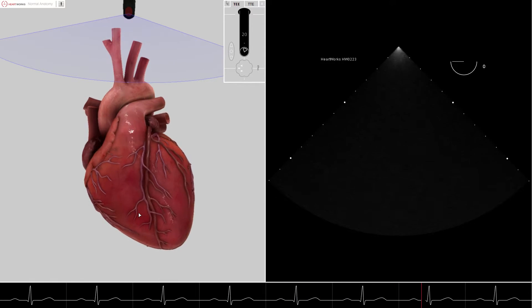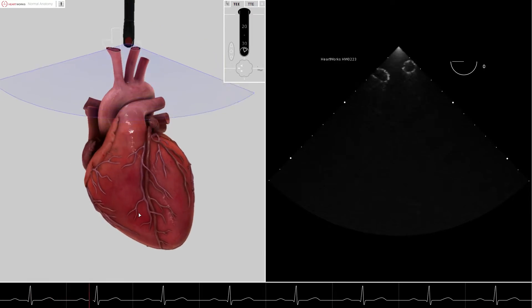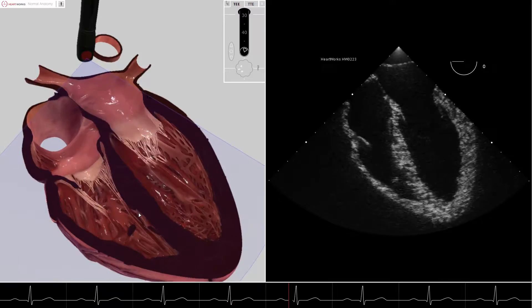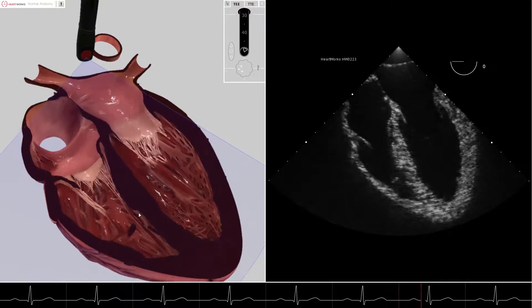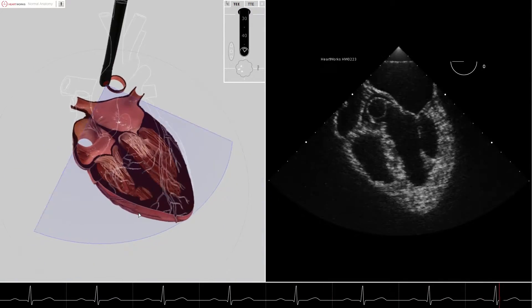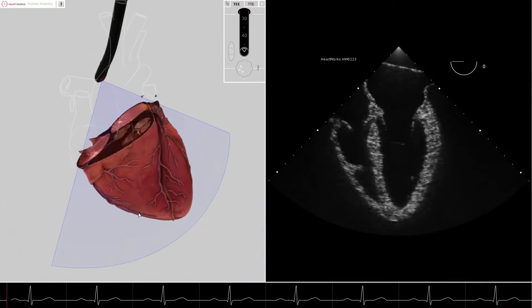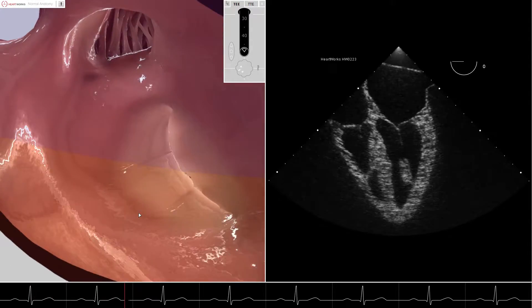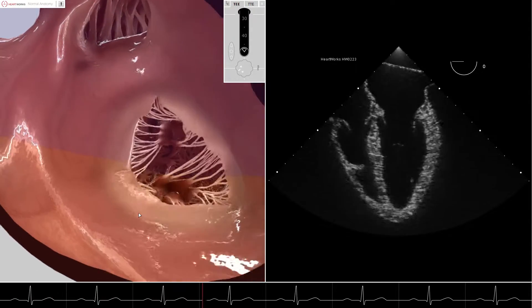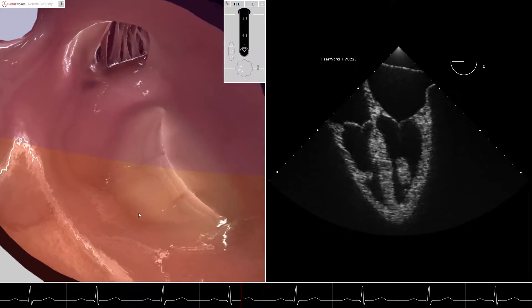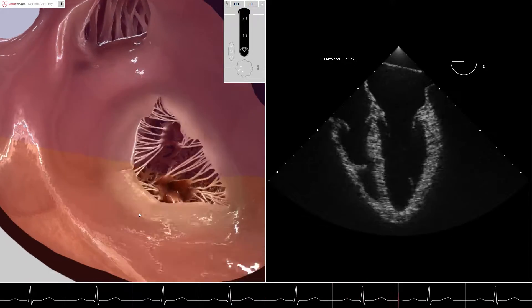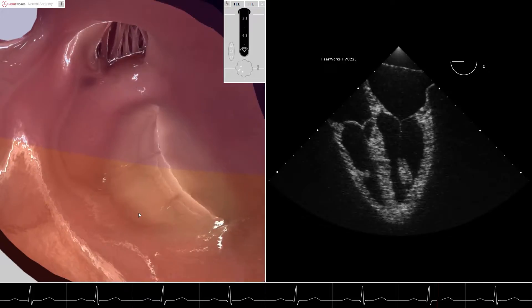We start this simulated transesophageal echocardiogram in the mid-esophageal four-chamber view. We manipulate the virtual reality view such that we are sitting in the mid-esophagus looking into the left atrium. Our view is very similar to the image that would be obtained by a 3D TEE transducer placed in the mid-esophagus.